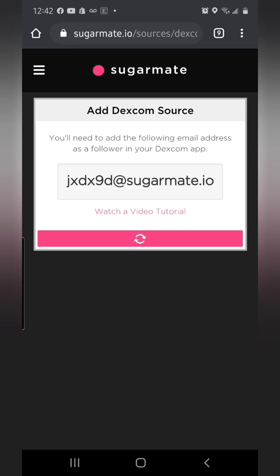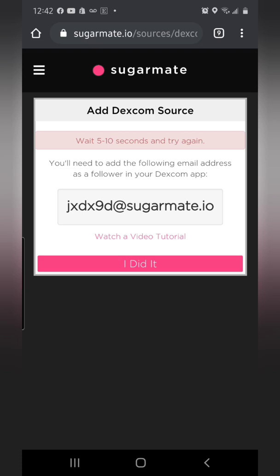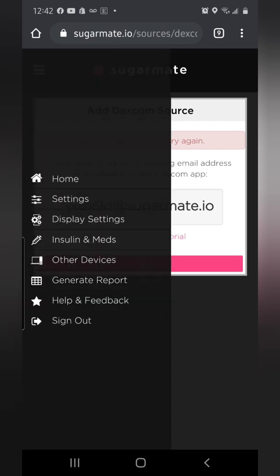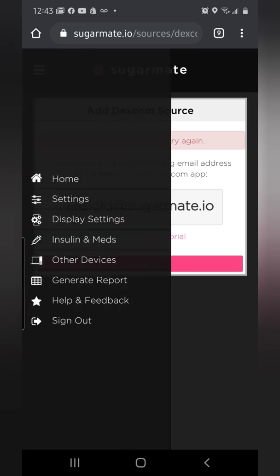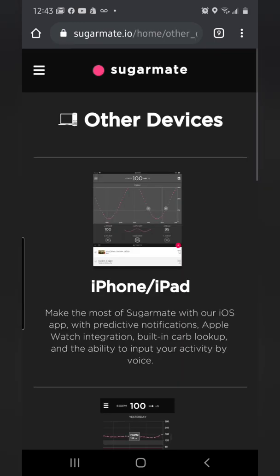It's going to have you wait and register. Once you've done that, go to the top left-hand corner — tap the three bars on the app to open the menu — and go to 'Other Devices.'